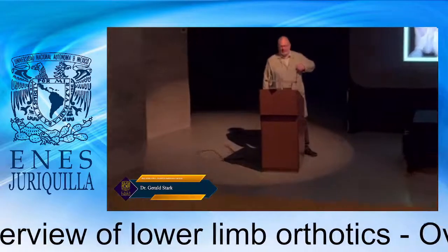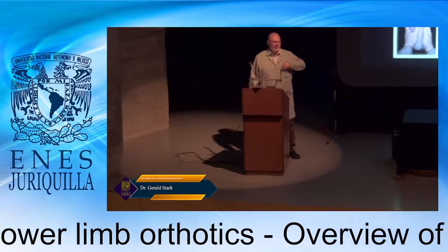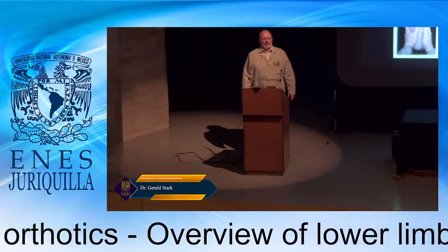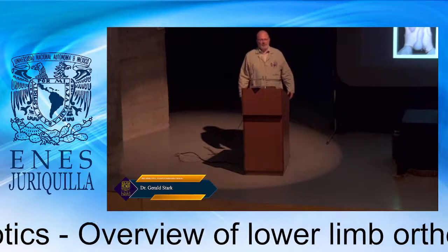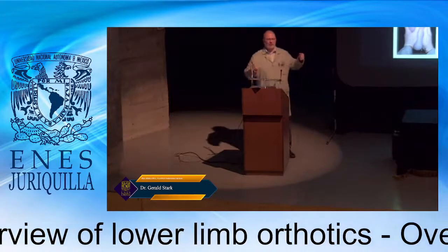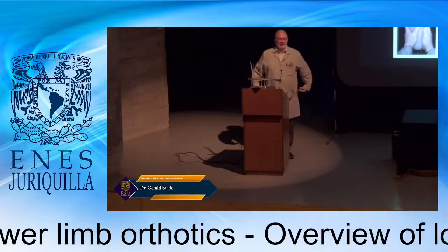My experience has been that for the most part, they work very well for children to have them upright. It helped them in terms of freeing their arms for mobility and also learning. So with children, they worked very well, but they had to be fitted properly.